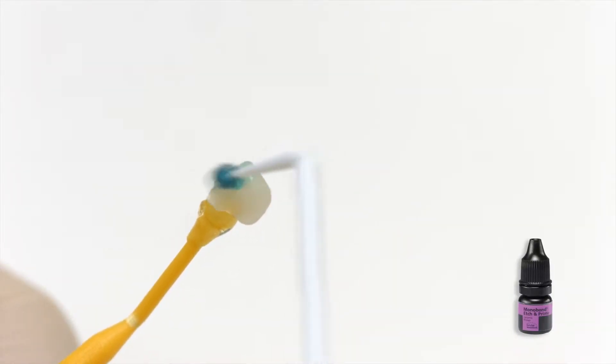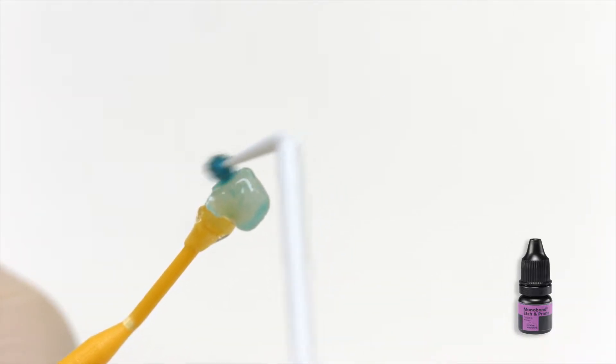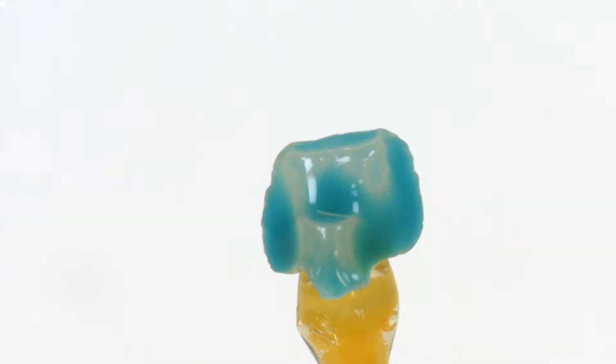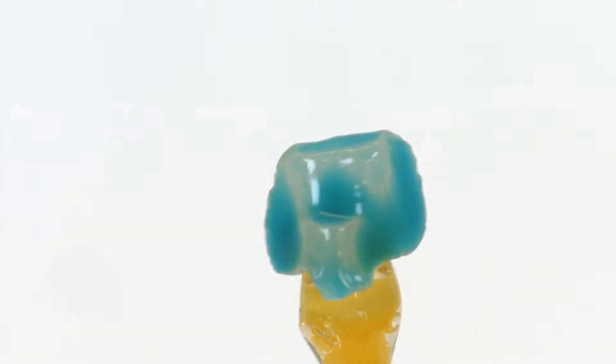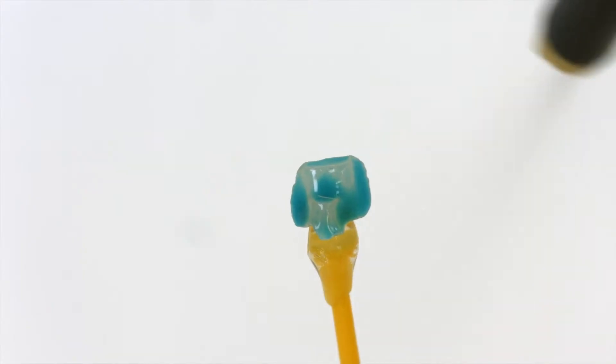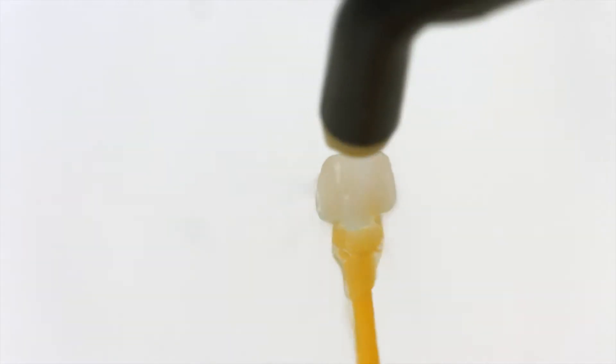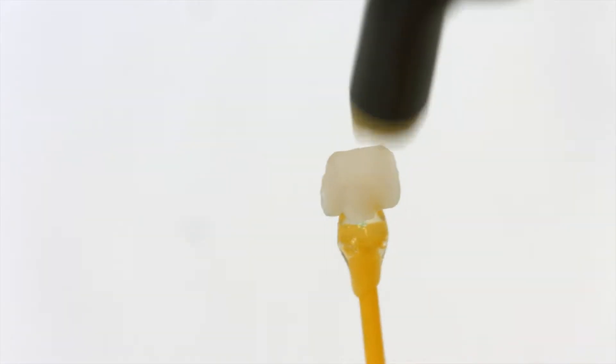Apply Monobond Etchin Prime bonding agent to the bonding surface with a micro brush and rub it onto the surface for 20 seconds. Allow it to react for 40 seconds. Rinse off Monobond Etchin Prime with water and thoroughly dry the restoration for 10 seconds with a strong stream of air.